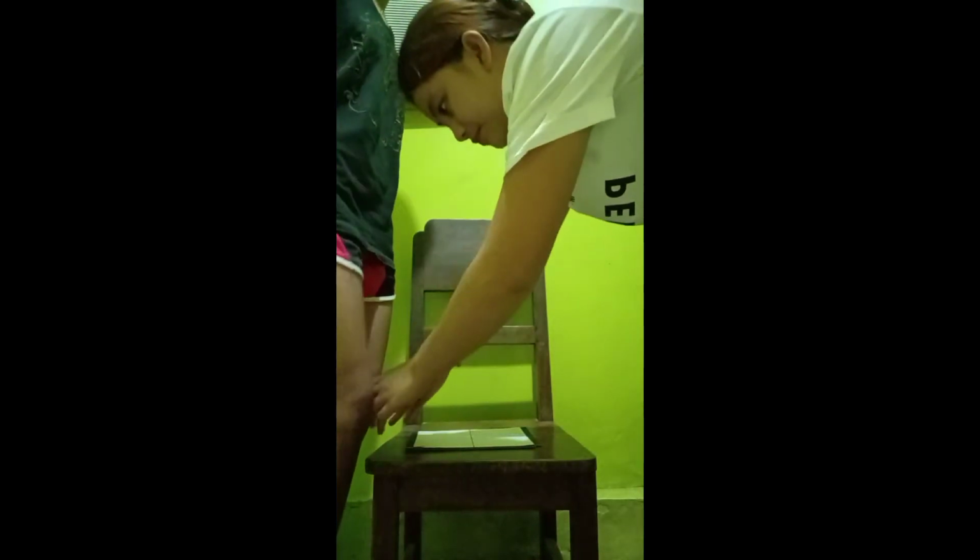The next projection that I will show you is the intercondylar fossa, or the different projections of my patient's intercondylar fossa. First is the PA Holmblad or PA axial Holmblad. Meron tayong unang way para ipakita yung projection na to. First, instruct the patient to be in standing position and flex the knee approximately 70 degrees from full extension.